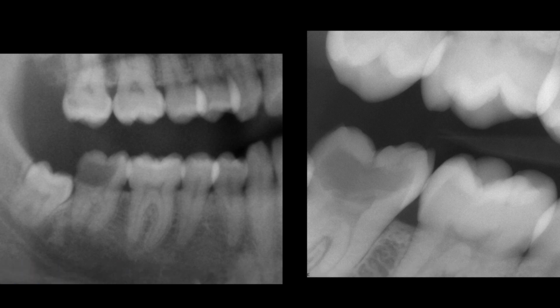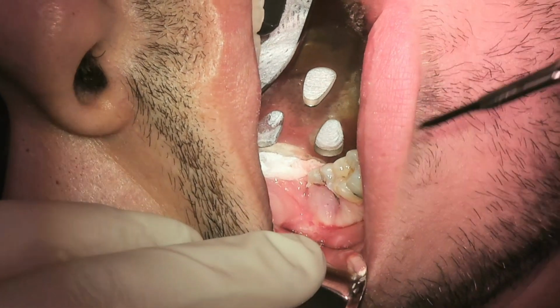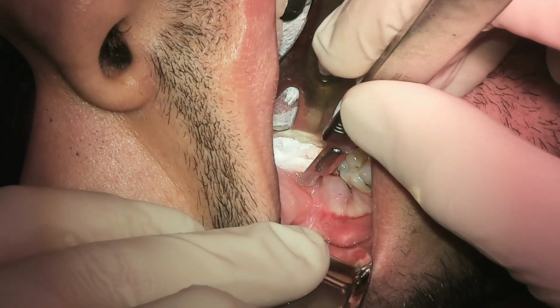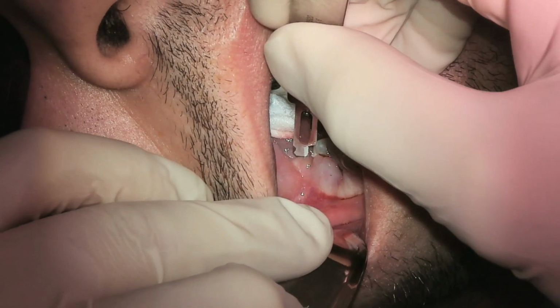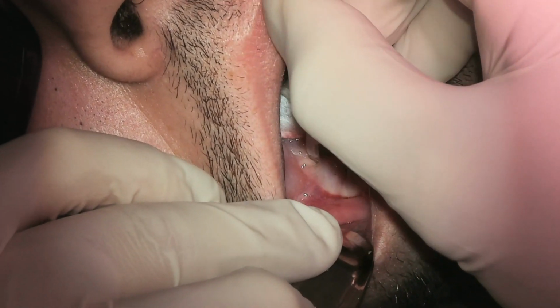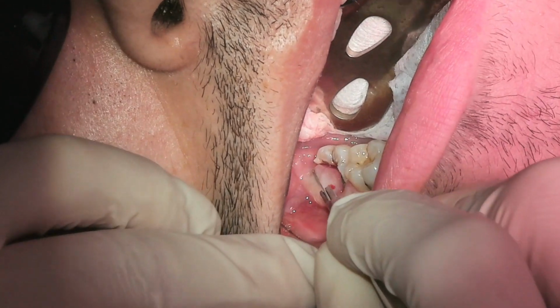Alright, Dr. Wynn here. Here's a case that we started on Friday. So, patient walks in, toothache, limited exam, go over risk, benefits, alternatives. He elects to extract the tooth. Very poor prognosis to hopeless, actually.